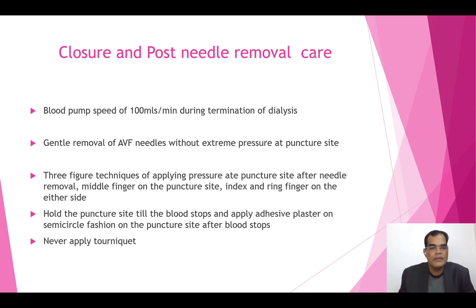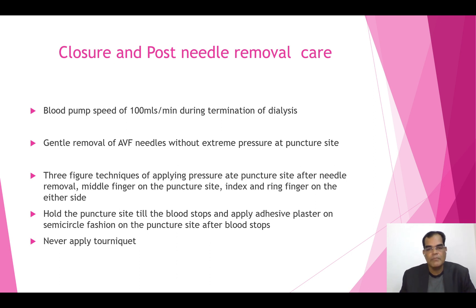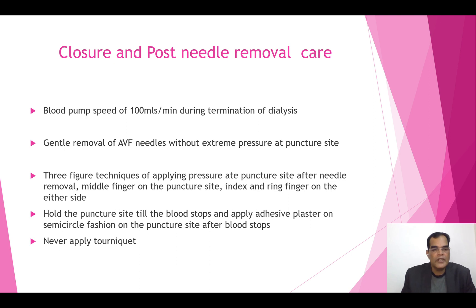The needle must be removed gently without applying extreme pressure on the puncture site, as this can cause extravasation and oozing around the puncture site. When removing the needle with gauze, use your middle finger to apply pressure and place the index and ring fingers on either side — this avoids exerting too much pressure on the puncture site. Hold until clotted, which normally takes five to six minutes.